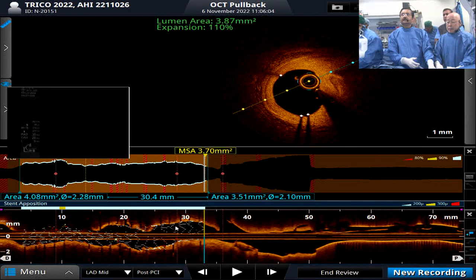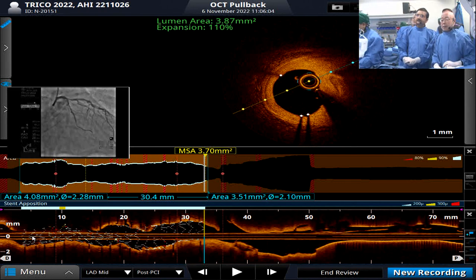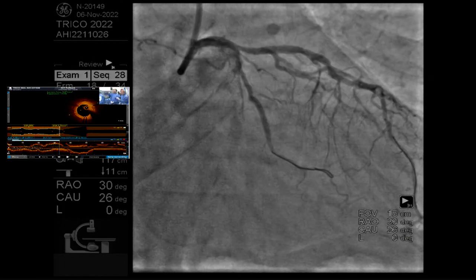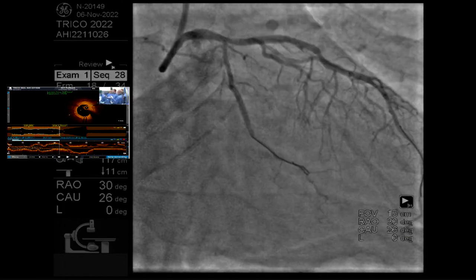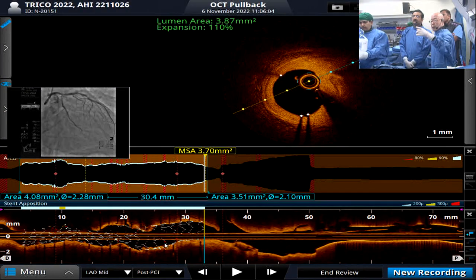We did a paper a couple of years ago that we called right coronary artery diverticula, because there was this huge positive remodeling that seemed to happen around stents. How do you differentiate malapposition from positive remodeling? A question for the imager.